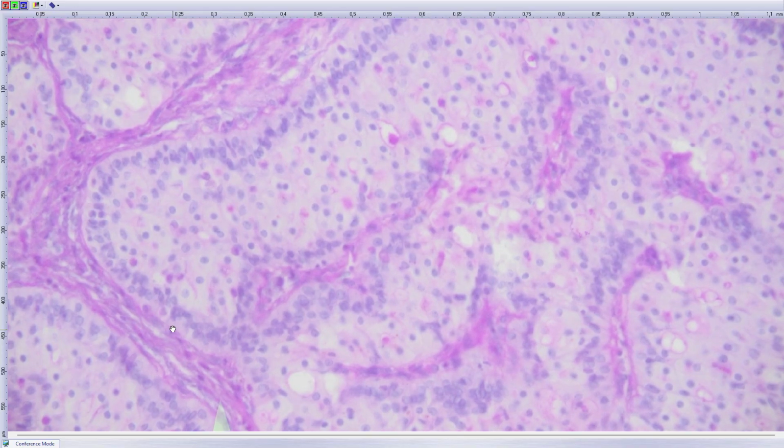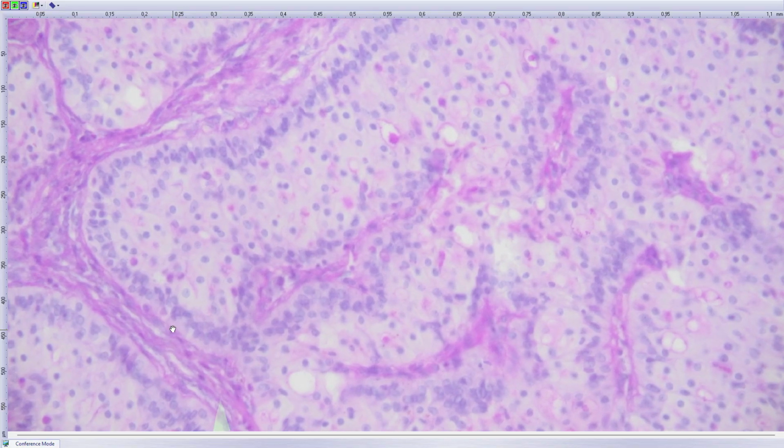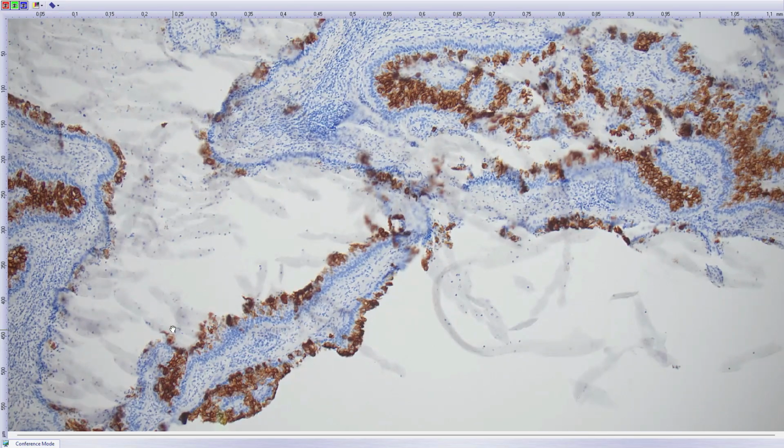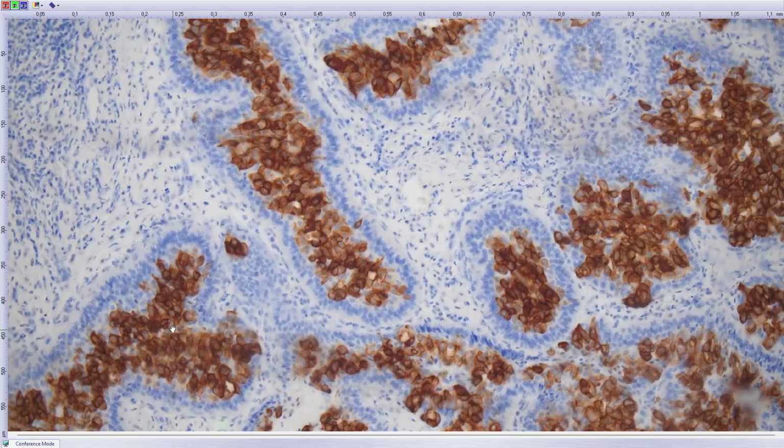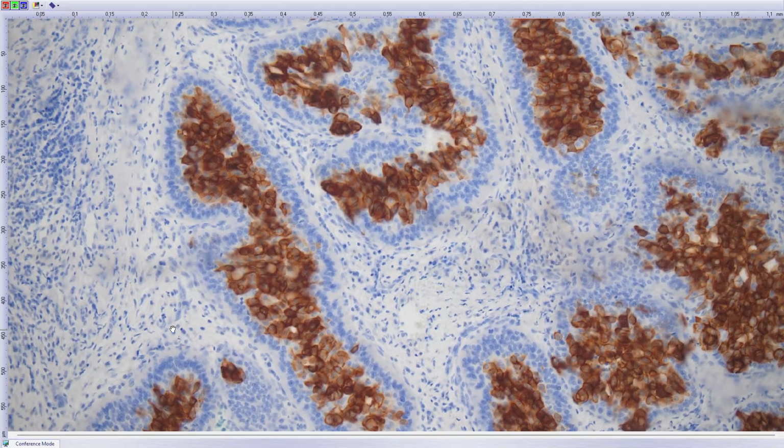So we call it low-grade, maybe benign tumor of salivary glands with oncocytic background and reverse polarity. It doesn't belong to any entity, yeah. It is cytokeratin 7 positive. Staining is very nicely showing it leaves out the peripheral layer and stains only the inner layer. That means the peripheral layer is really something distinguished, very nicely distinguishable in the tumor.